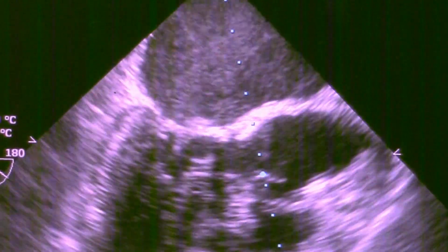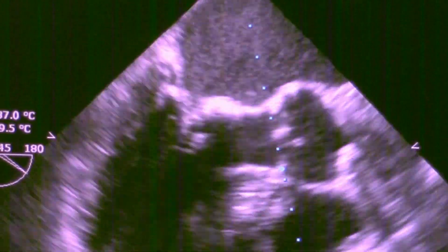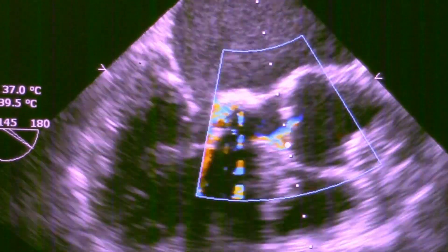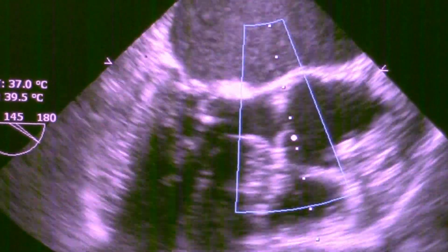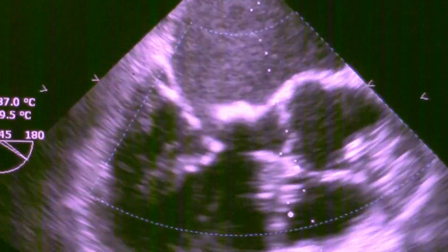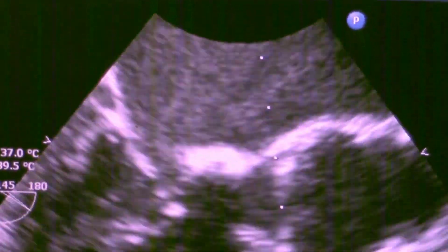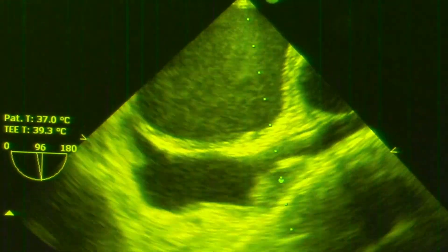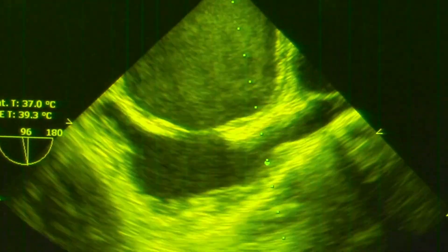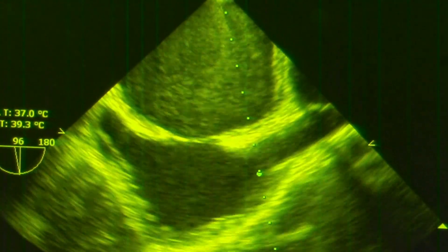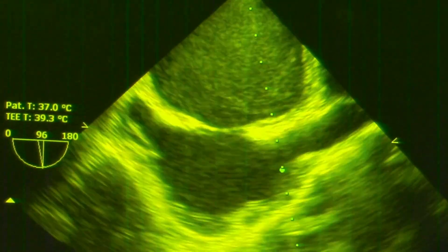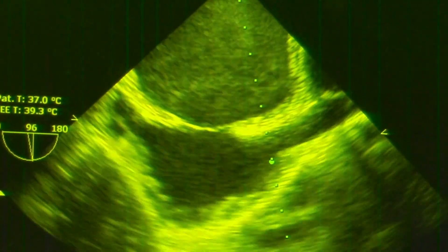Left atrial spontaneous echo contrast usually starts in the left atrial appendage — here you can't see it — and tends to grow within the left atrium. It is graded either as mild, moderate, or severe, or by the recent classification of Fatkin et al., which grades it from 0 to 4, with 4 being the severe form.